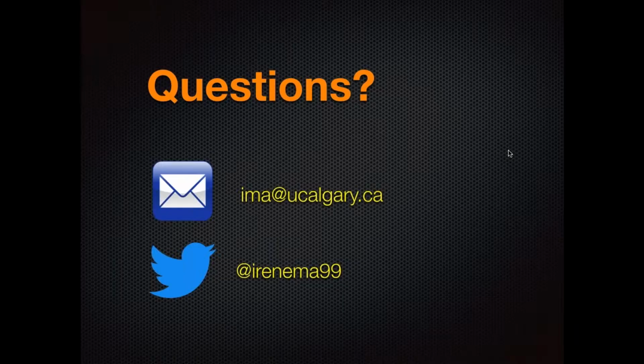The next question I have here is how to quantify free fluid in the abdomen. That's actually a really good question.